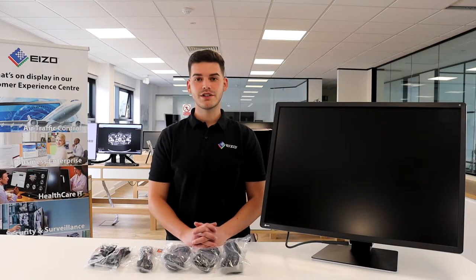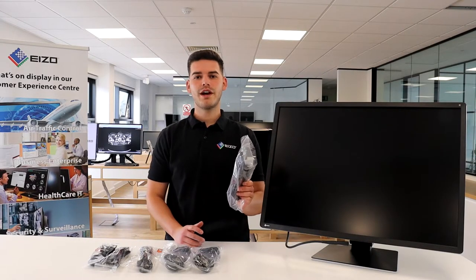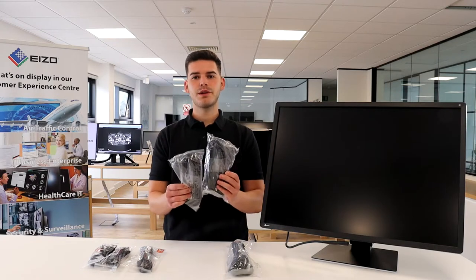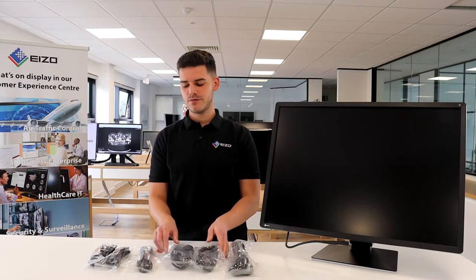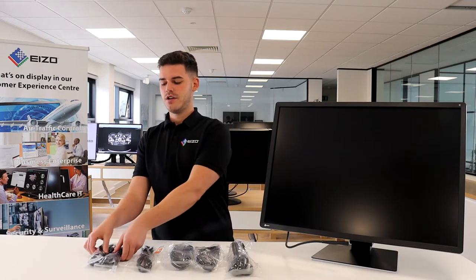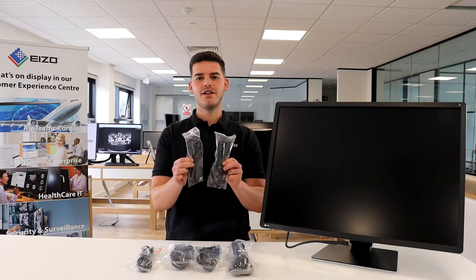The cables supplied in the box include one UK mains power cord, two DisplayPort to DisplayPort cables, one HDMI to HDMI cable, and two USB-A to B cables.